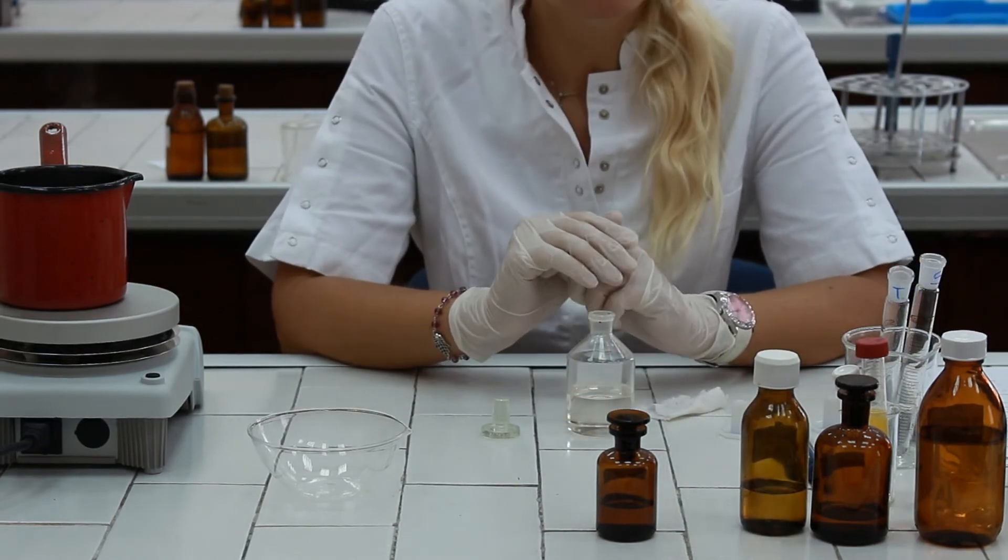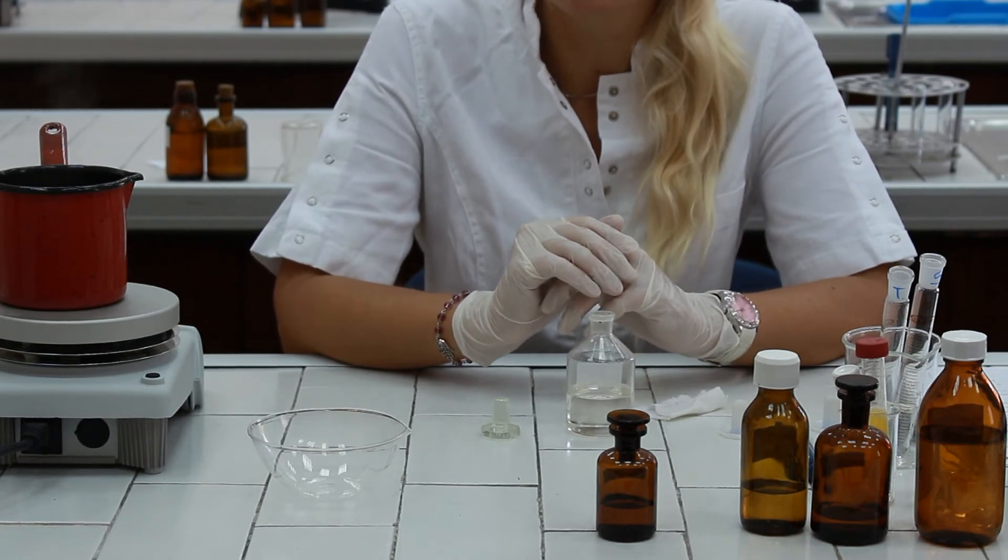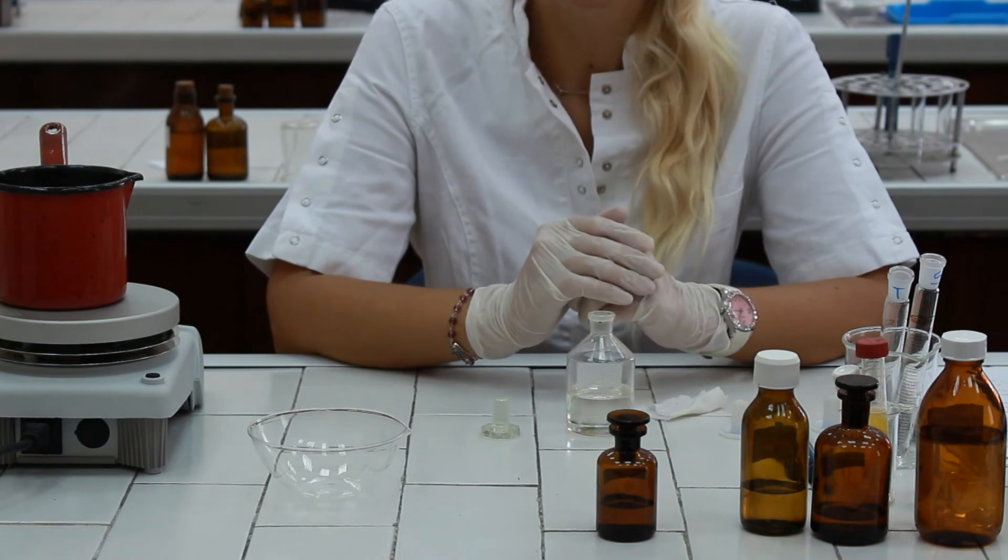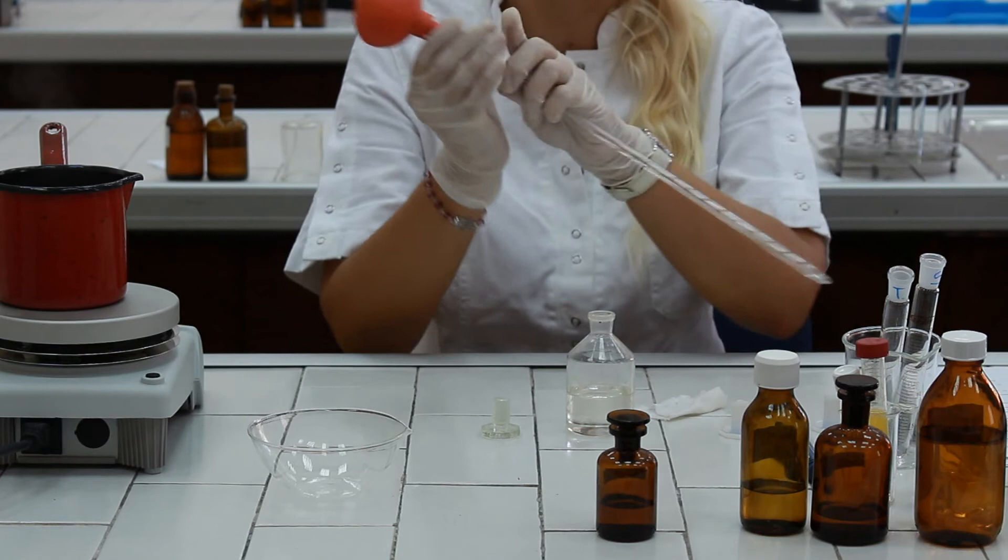After we prepare the chloroform solution of the cholesterol, now we have to perform the Lieberman-Burchard colored reaction. We need to put 2 ml of acetic anhydride to each of those graduated cylinders.